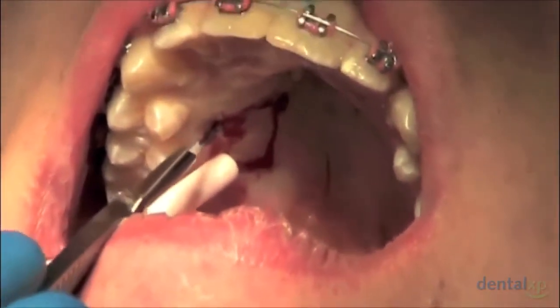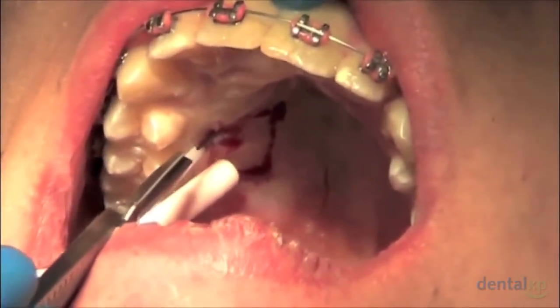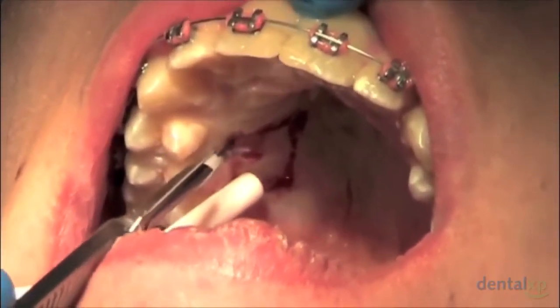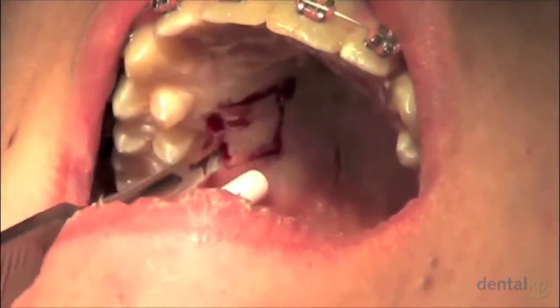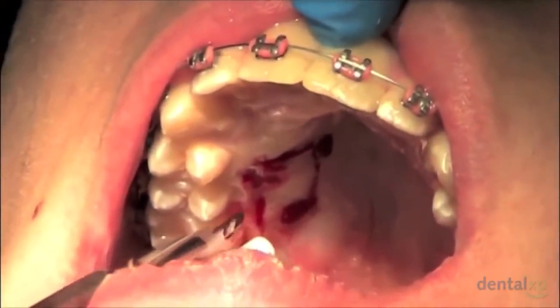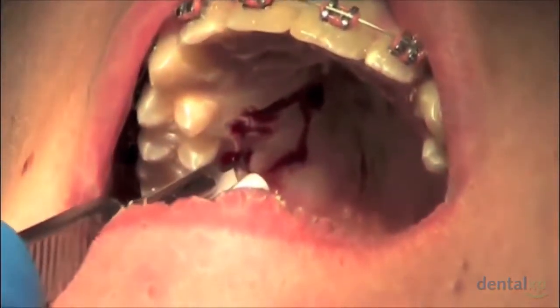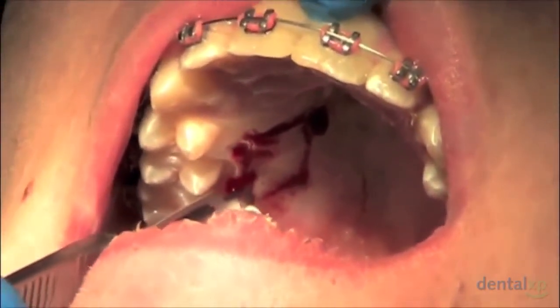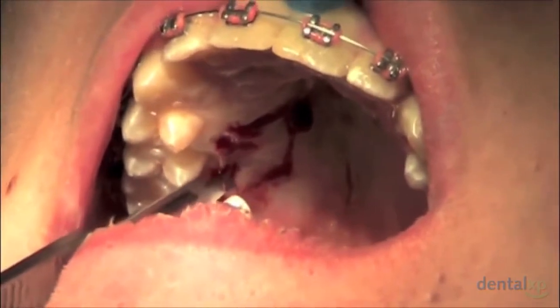For teeth numbers 24 and 25, you'll typically need between 9 and 12 millimeters of tissue. As far as the depth is concerned, I generally like to make mine about 9 millimeters in depth. The reason for this is because I typically will harvest the tissue first and prepare the recipient site second.